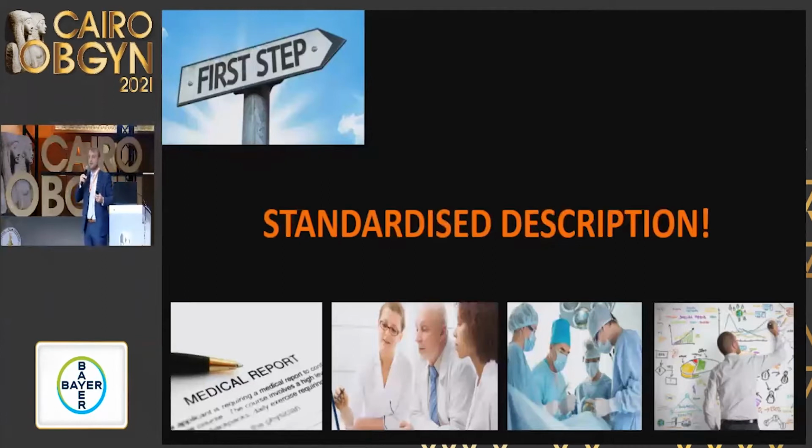If for you that's 6 or 7 millimeters, that's a different definition. And then you cannot really trust the results if you apply any of the IOTA methods.